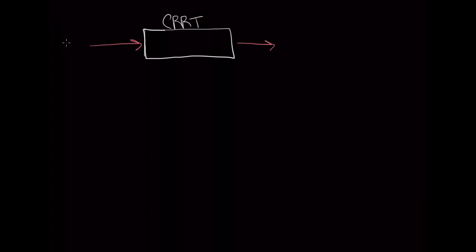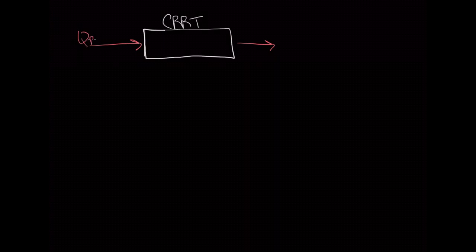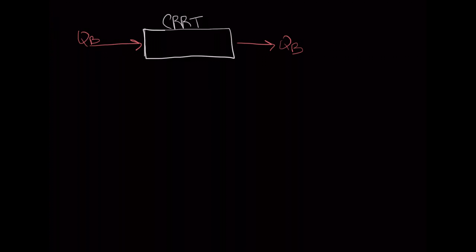And this is the blood flow coming in and the blood flow going out. And we're going to make this the effluent. Here's your effluent flow. And so the filtration fraction is really a very simple mathematical equation, but it's going to be helpful for you because it'll hopefully keep you asleep at night.